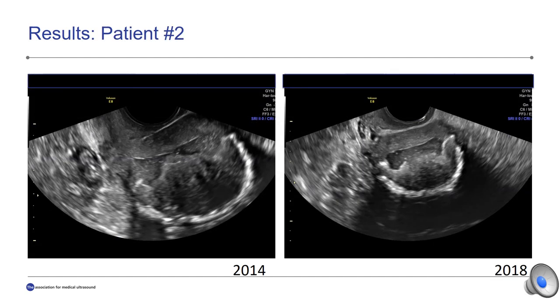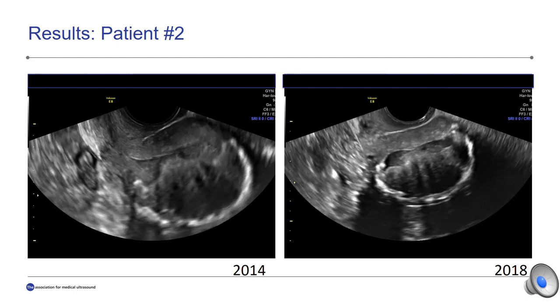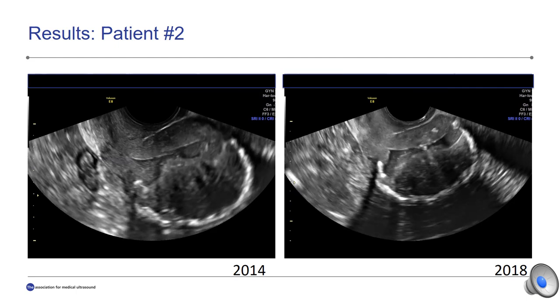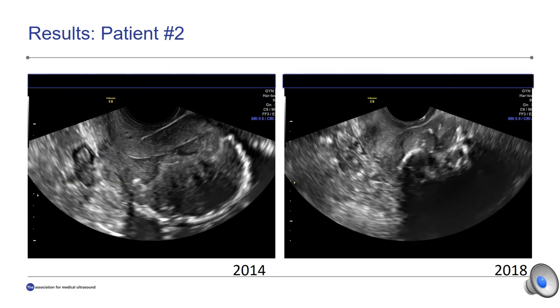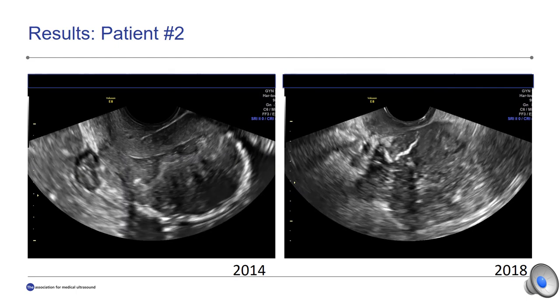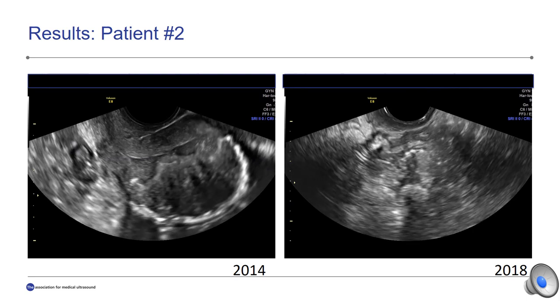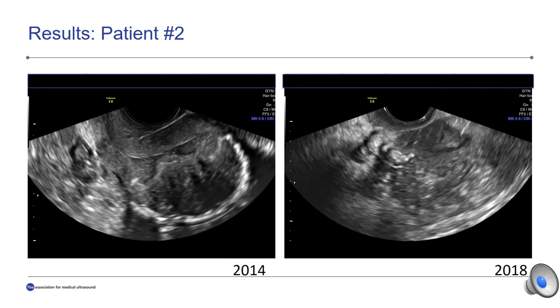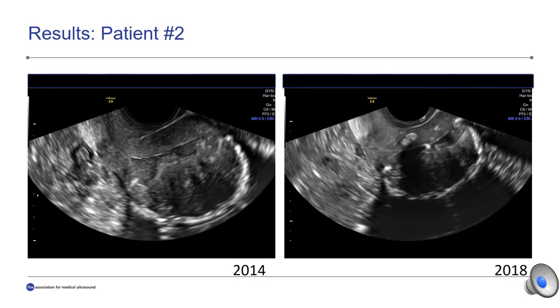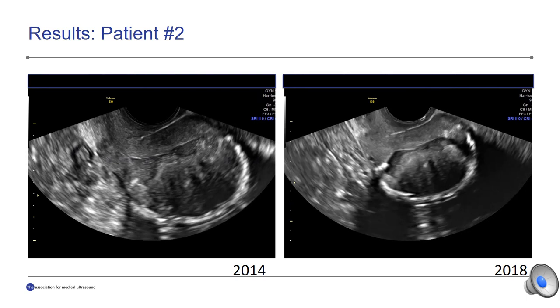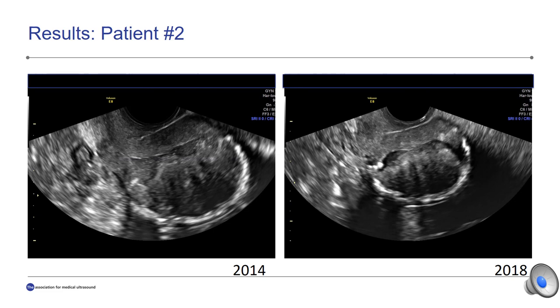Live-action clips from ultrasonography of patient number two are added to better visualize and compare the fluid collection seen — on the left is 2014 and on the right is 2018.